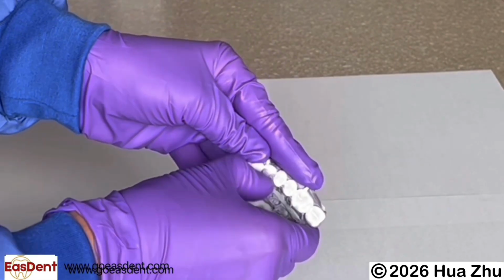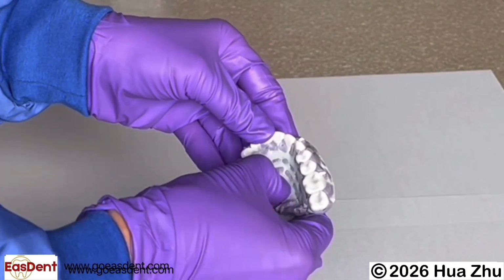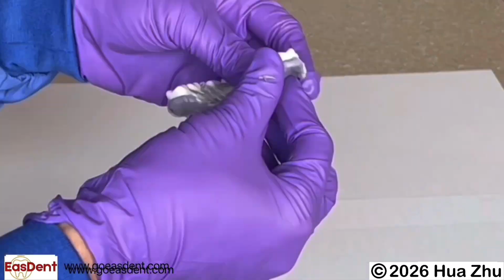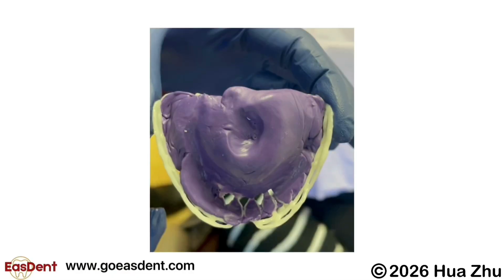Putty impression material will self-set completely in about 5 minutes. In case the putty material is set before you are happy with the teeth position, quickly peel off the material before it sets further and repeat the procedure again. Now you have a customized maxillary Easdent tray with the correct teeth position.